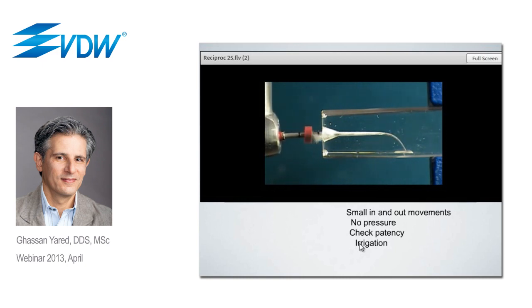You do not apply pressure on the instrument. You will see that the instrument will advance very easily in the canal. Again, very small in and out movements, 3 to 5 millimeters, 3 times, you take it out, you irrigate to clean.